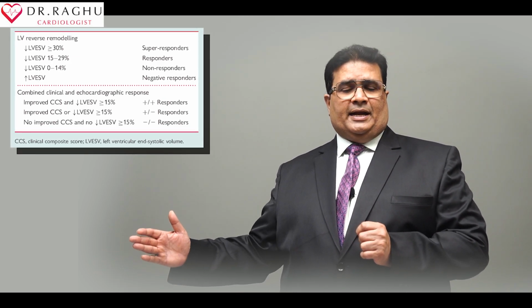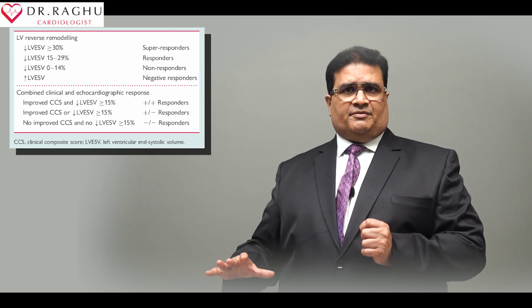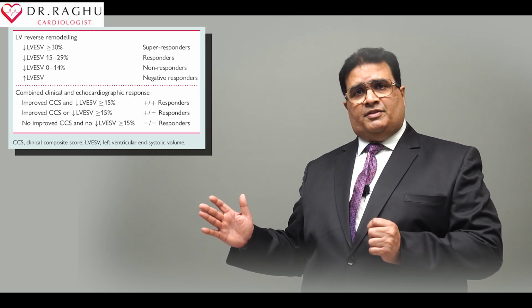heart pumping ability. Whereas in responders, we can expect about 20 to 25% improvement of the heart function, whereas non-responders might not show such a dramatic improvement of the heart pumping.